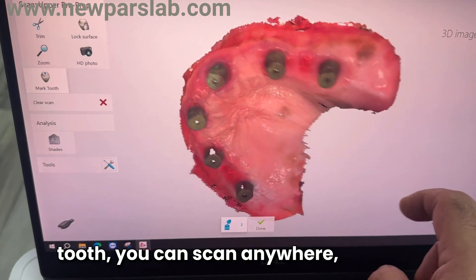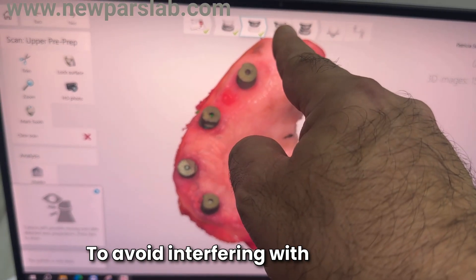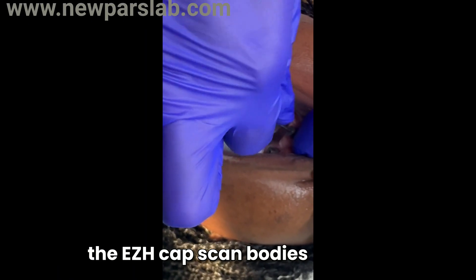When prompted to mark the implant tooth, you can scan anywhere, but choose an area that isn't essential for the final scan to avoid interfering with the main data. Carefully remove the EZH cap scan bodies.